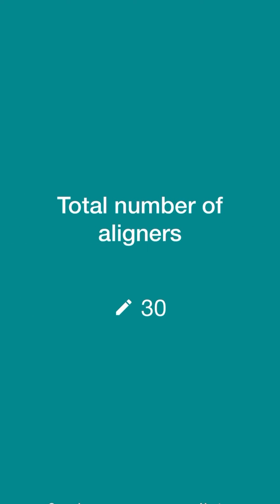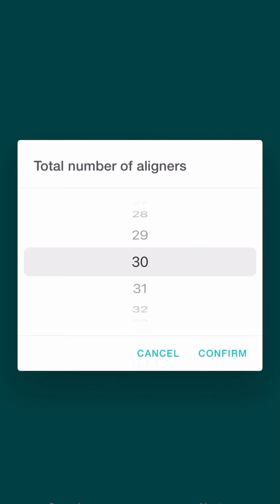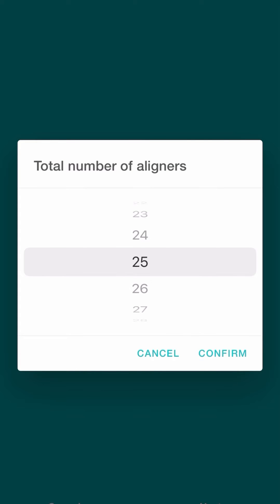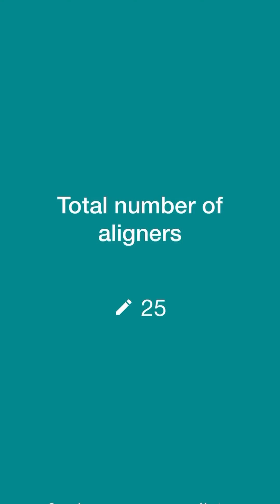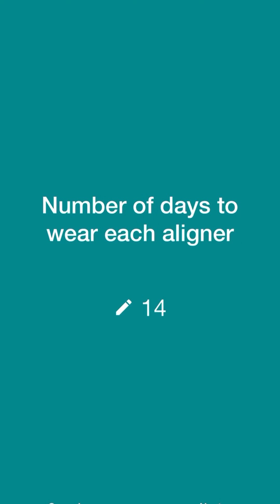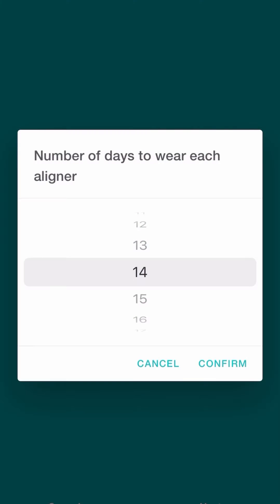Total number of aligners — you'll be able to select that by looking at your individual plan. Number of days to wear each aligner: your dental provider will tell you how many days to wear each aligner for.